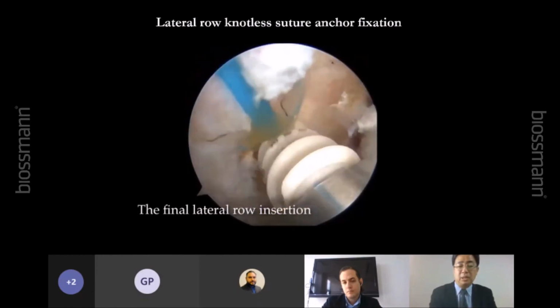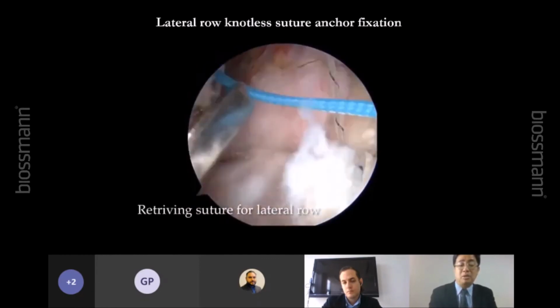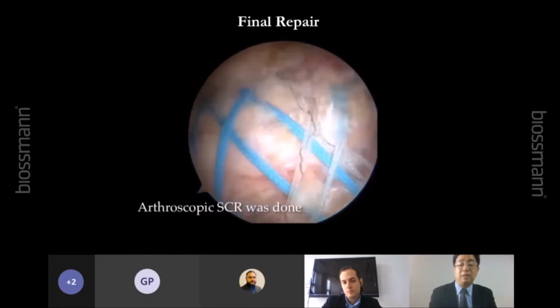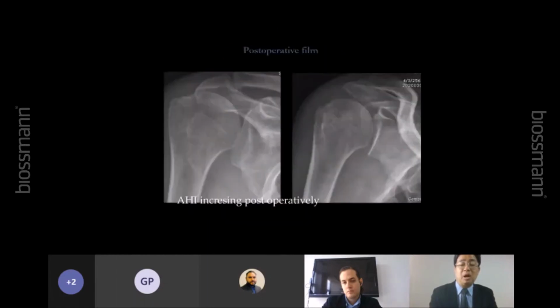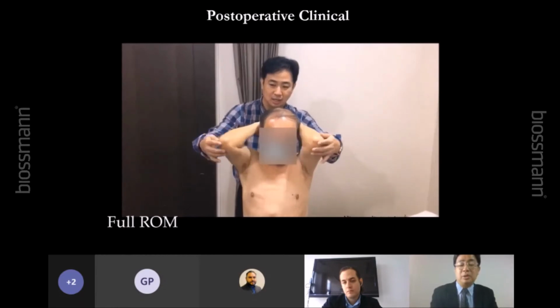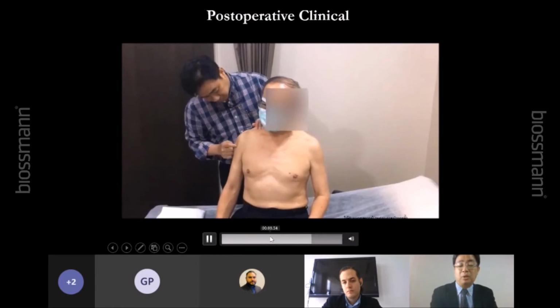And we have pretty good results with the superior capsular reconstruction. So this is the final repair. This is pre-op, post-op. You see that the acromiohumeral interval is getting much better after the surgery, and there's good healing of the superior capsular reconstruction graft. So this is a clinical outcome. The patient has good function and also good strength of the rotator cuff.